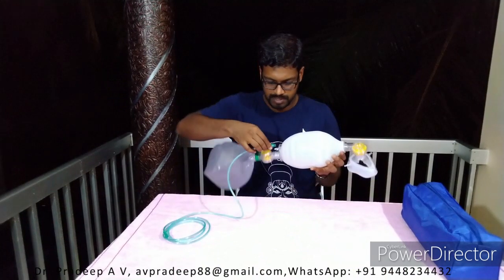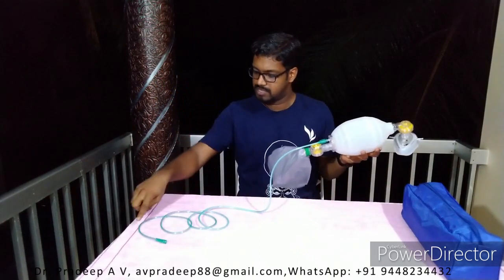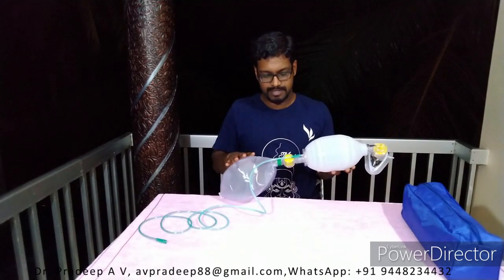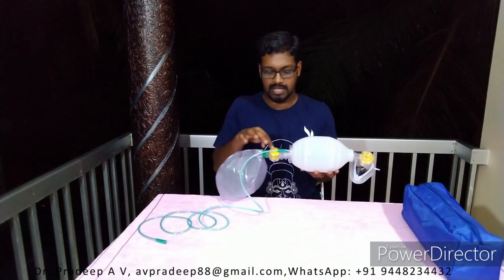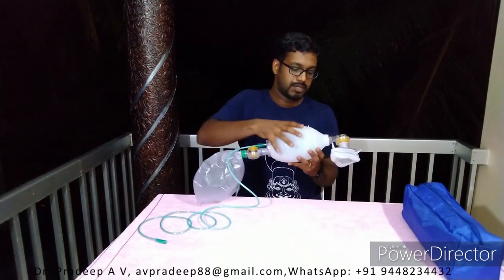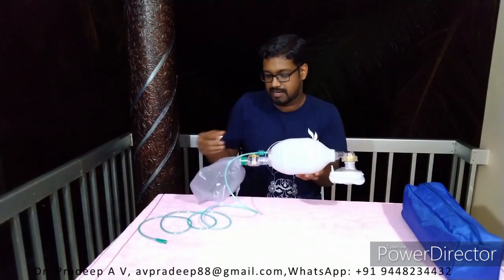I have finished almost the assembly. So this is supposed to be connected here. The other end of the pipe goes to the oxygen cylinder. The oxygen comes through this pipe and all the way comes here and goes back, filling this bag. Now this bag will be filled with oxygen, and if there is an excess pressure, this valve will open, and if there's a very low pressure, the other valve will open. So this is a valve for controlling oxygen pressure, basically the inlet pressure to this silicone bag. Now if you press, some air will go through this, and if you relax it, air comes from here.